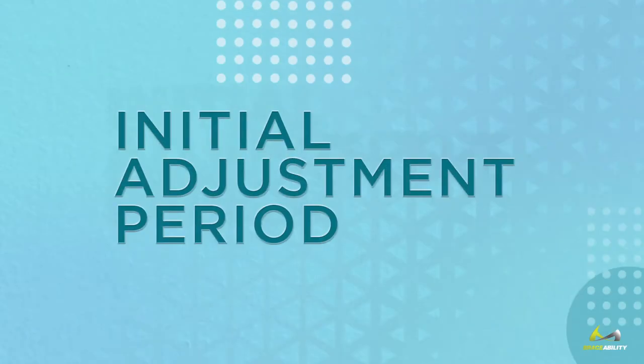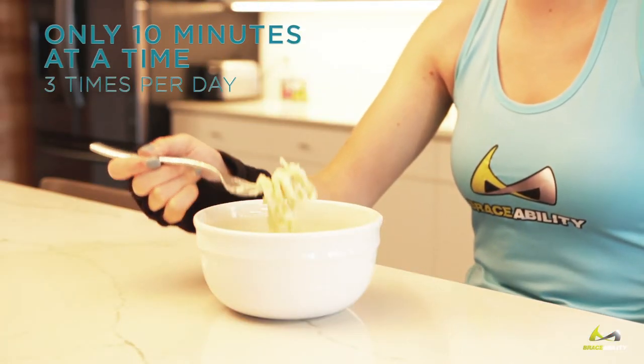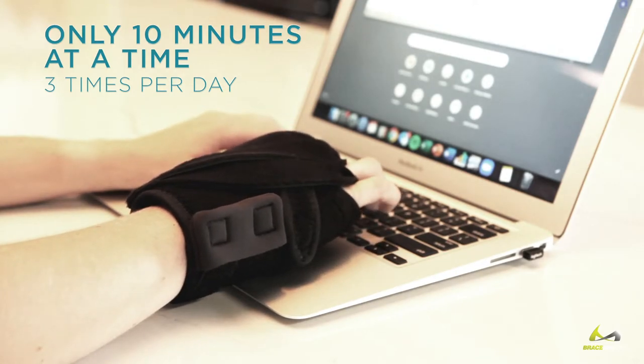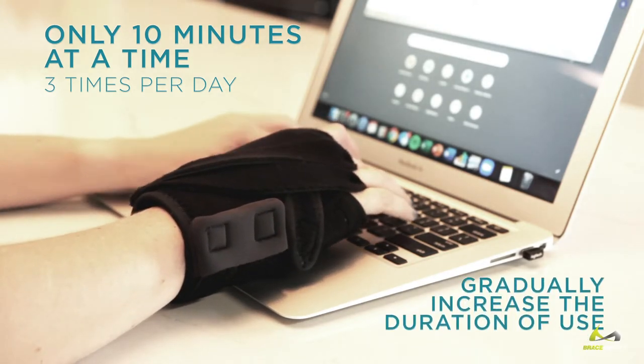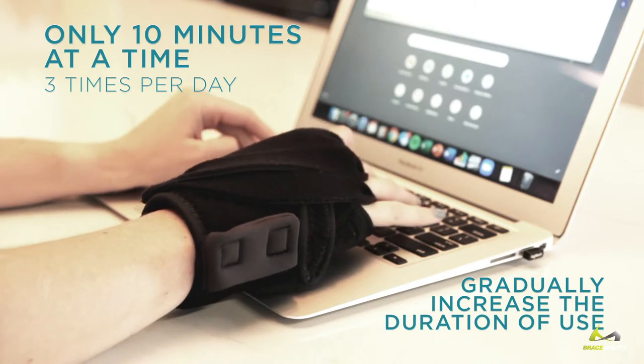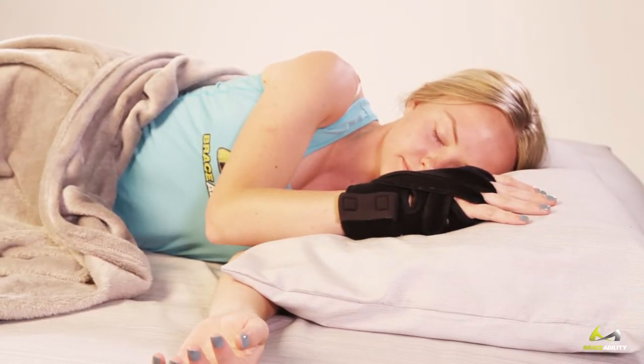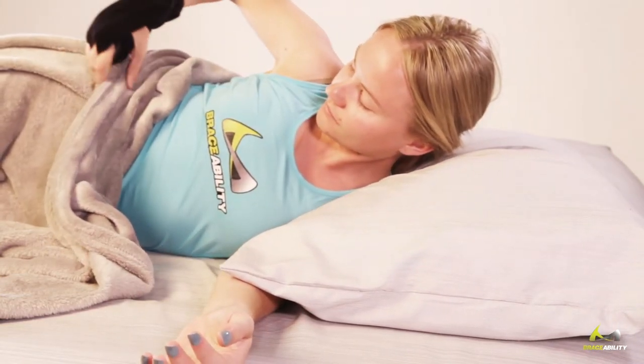Initial Adjustment Period. Begin by wearing for only 10 minutes at a time, three times per day. Over the course of several days, gradually increase the duration of use. You will get sore if you wear it for too long at first. Eventually, work up to wearing the splint overnight, since pain intensity is typically the worst in the morning.